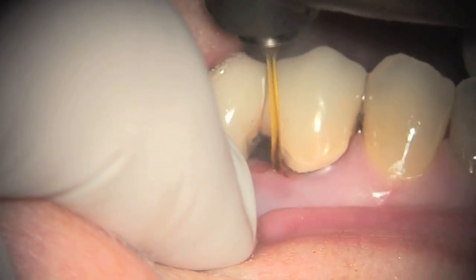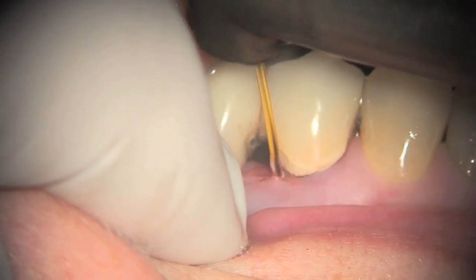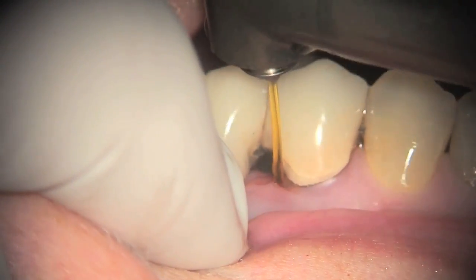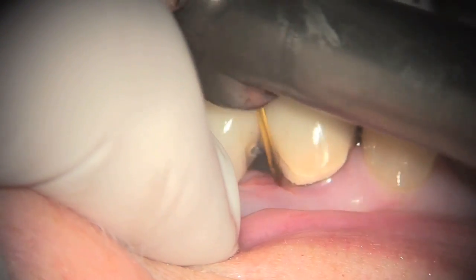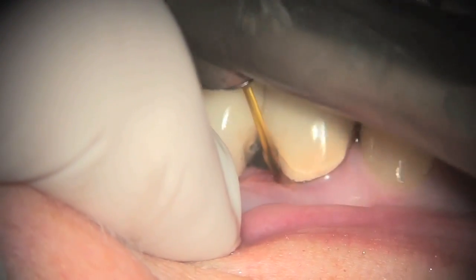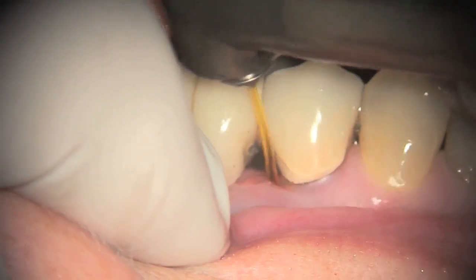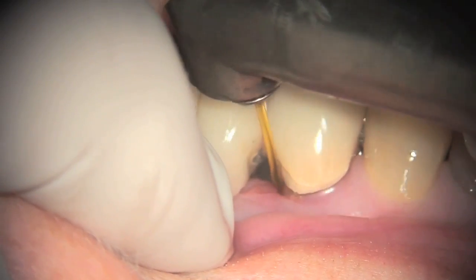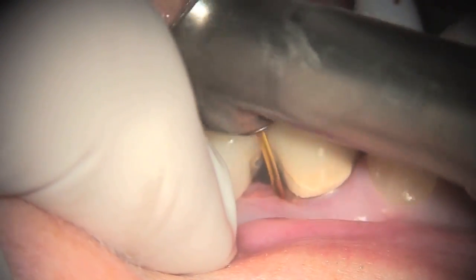The erbium laser, in this case, is used for fine scaling. We start at the top of the sulcus and work our way down on the root surface until we come in contact with calculus, and then we tap off the deposit. Not only are we removing calculus, but we are also decontaminating the root surface and getting rid of the endotoxins, and doing a substantial amount of bacterial reduction in the pocket.